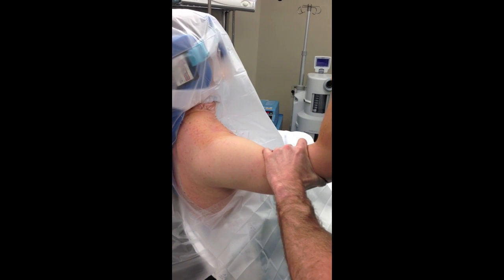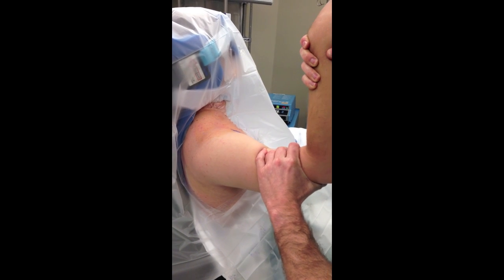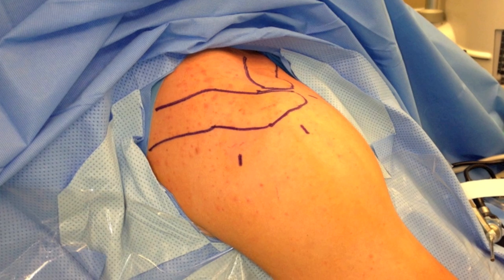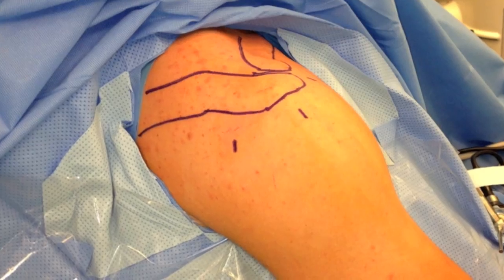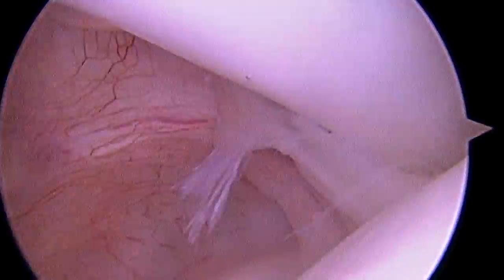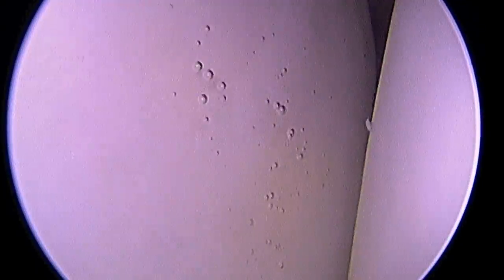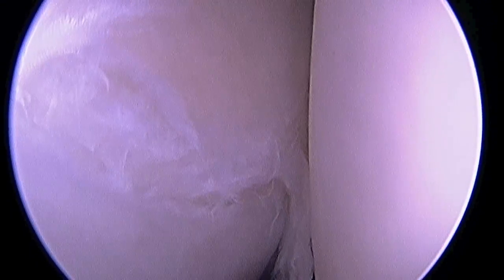So here we are at surgery with the patient asleep. You can see on my examination under anesthesia how the ball of the shoulder slides easily out of the socket. With the patient prepped, here you see the three portals that we're going to use to perform this surgery. Now, first we're looking from posterior to anterior, or towards the front of the shoulder. There you see the subscapularis tendon, the biceps tendon above us, and then some of the rotator cuff. The ball of the shoulder is to my right, the cup of the shoulder is to my left. And there you see a wisp of frayed tissue. It's very difficult to visualize the posterior labrum when looking from posterior because the camera is right on top of the tear.